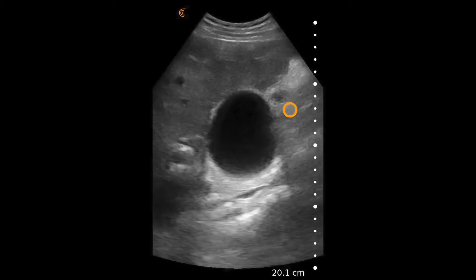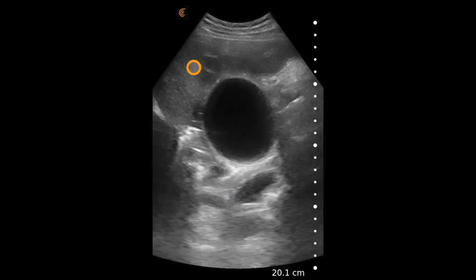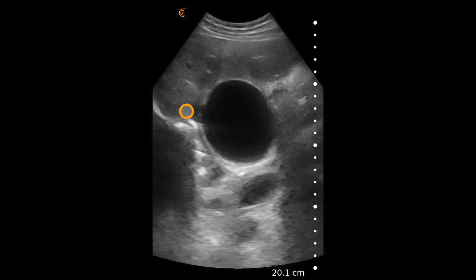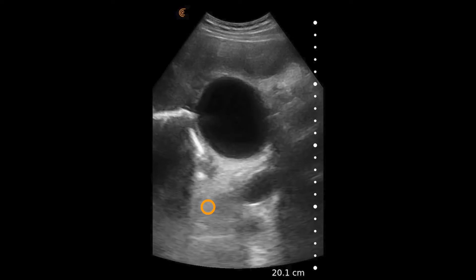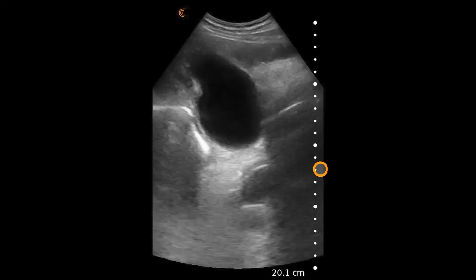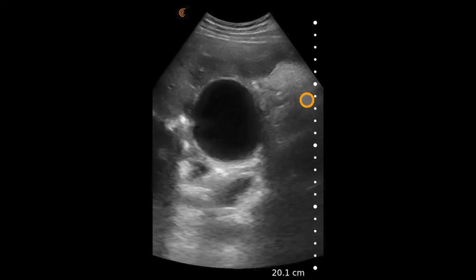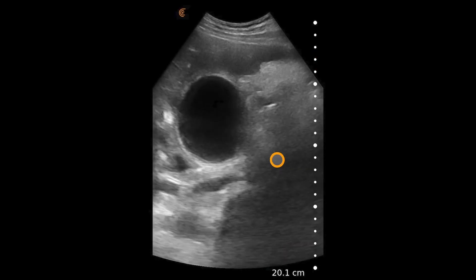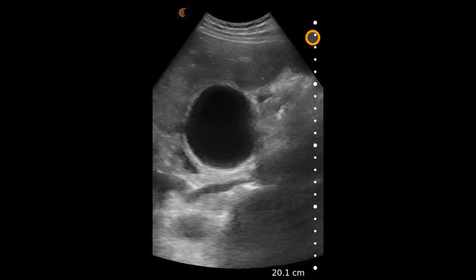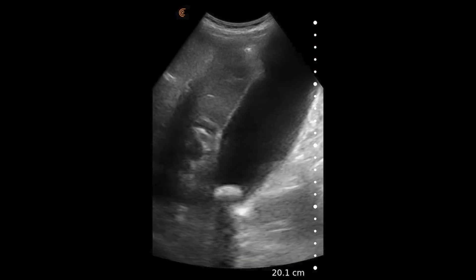Combined with a sonographic Murphy sign, these findings would be consistent with acute cholecystitis. To confirm, the transducer would be rotated to get a longitudinal view as well, to really identify that gallstone in the neck of the gallbladder and see the full longitudinal aspect of the gallbladder.